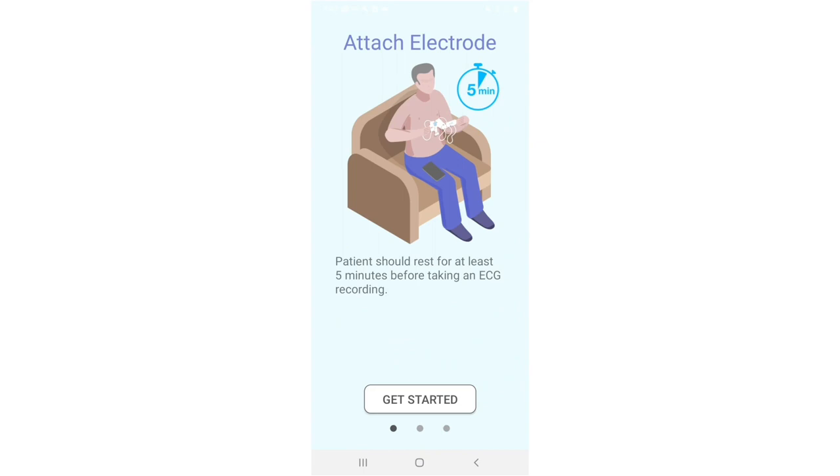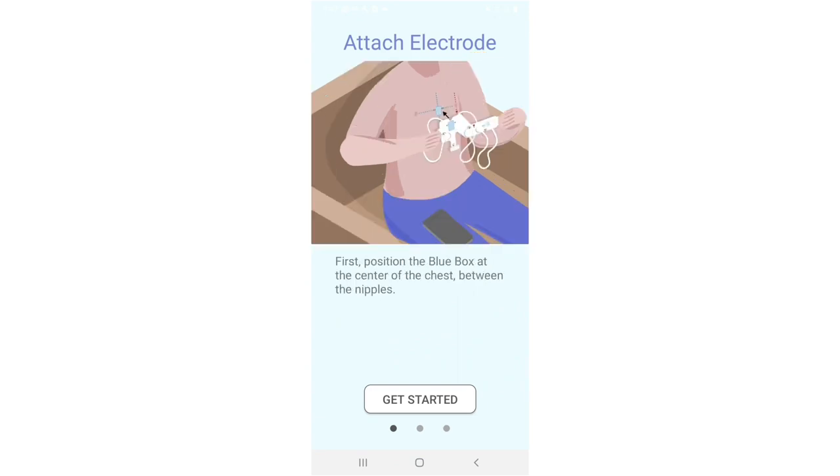Attach the electrodes. Patients should rest for at least five minutes before taking an ECG recording. First, position the blue box at the center of the chest between the nipples.